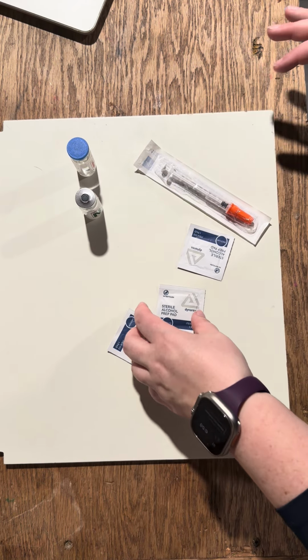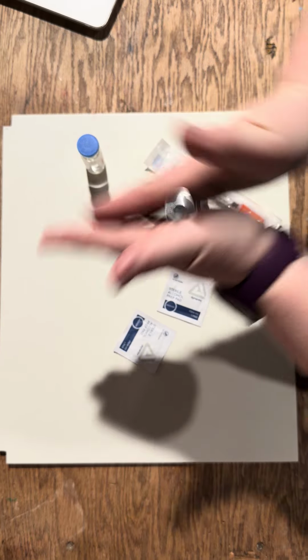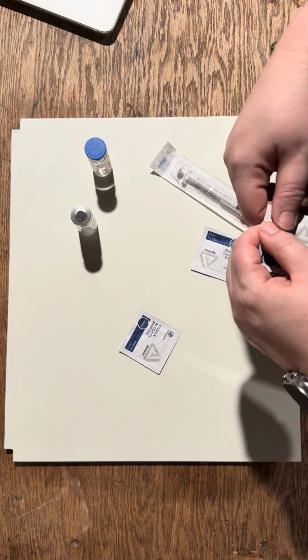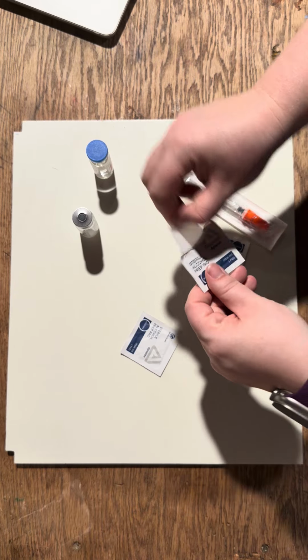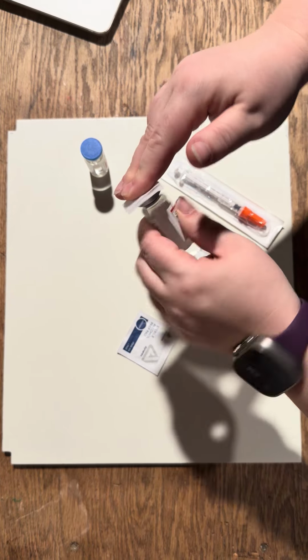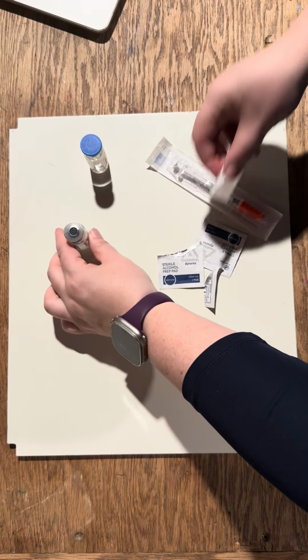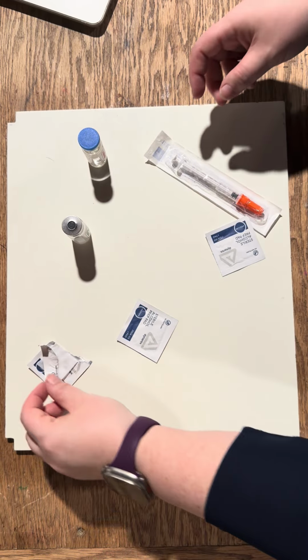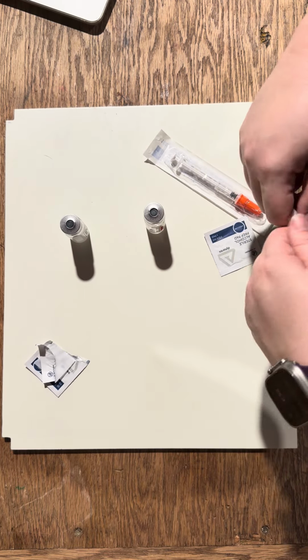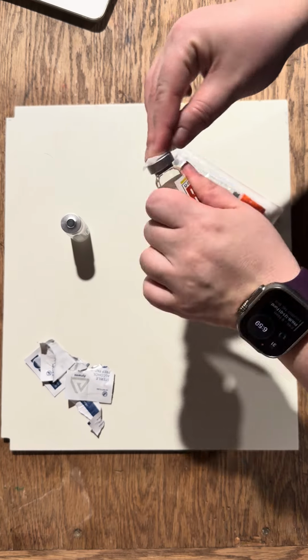So now I will take my NPH, and you need to roll it, not shake it. Now that it's nice and mixed, I will take my alcohol swab, and I will ensure that the top of the vial is sterile. And then I will pop the top off of the regular insulin and do the same thing, ensuring sterility.